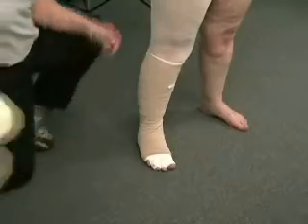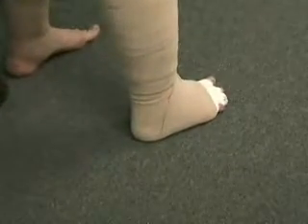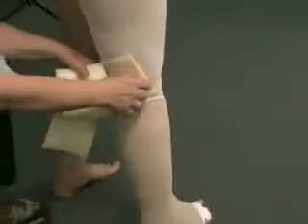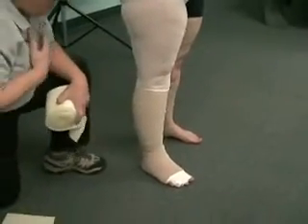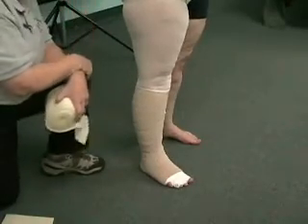Now the next part you're going to want to do. Are you able to see this? Yeah. Okay, just turn sideways. Just so you can see, I'm going to put some padding back here, and you have a little square. That's what this pad is for, to cover this. Okay, you're going to turn sideways to me, just like that. I like to bandage my patients, anyone I'm bandaging, in this direction rather than in the front. I don't like them facing me.